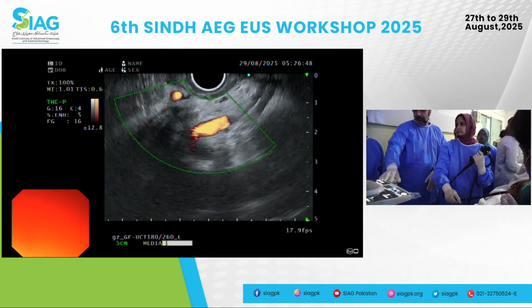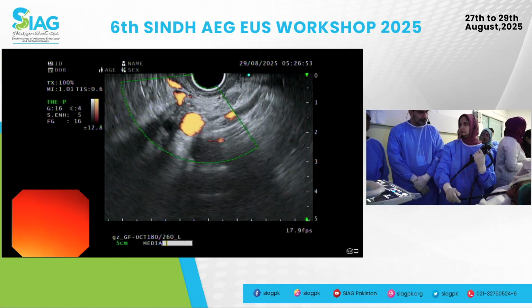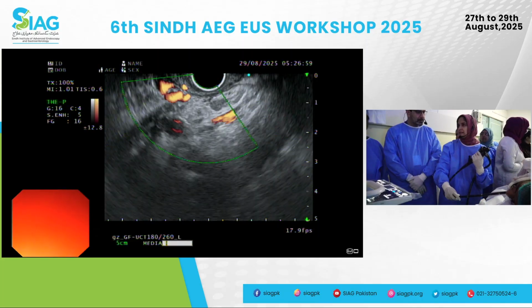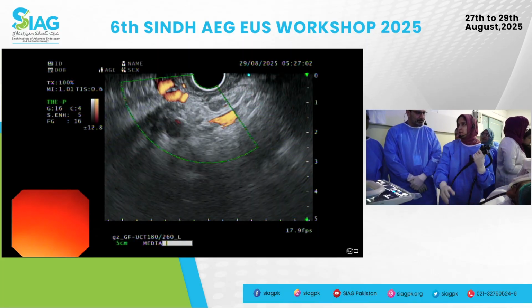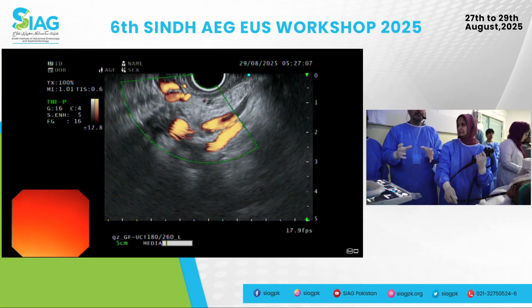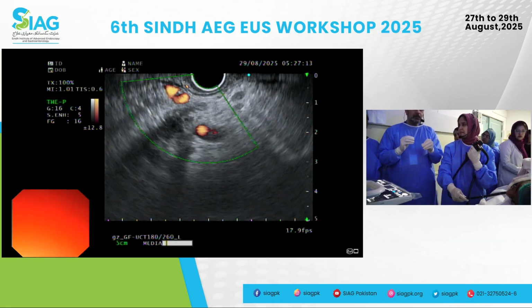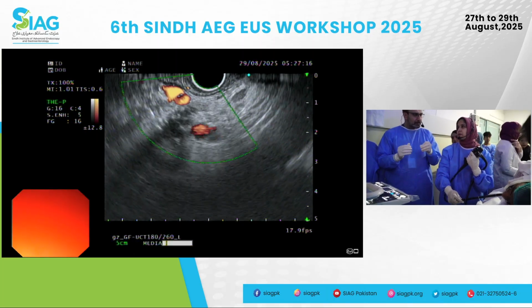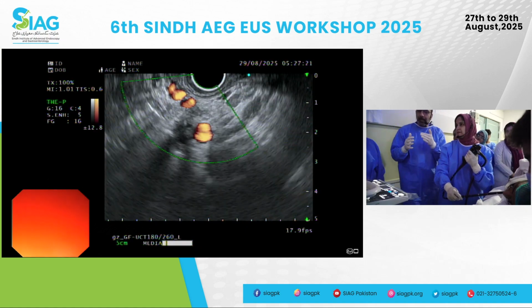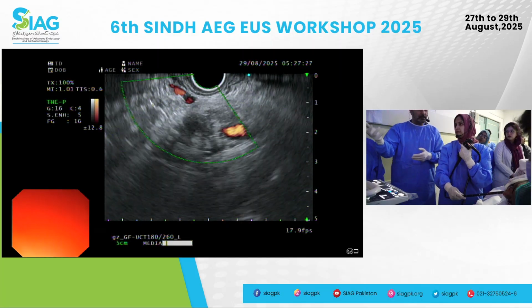What's the difference between varices and collaterals? Varices are the result of portal hypertension basically. Collaterals are smaller vessels that develop around a blocked vessel. Okay, so varices and collaterals are the same thing depending on where you see them. Anything that is intraluminal that you see submucosal, that's a varix, whether that's gastric or esophageal. Anything that is outside the organ, outside the gastric wall, in the perisplenic region, that would be a collateral vessel.